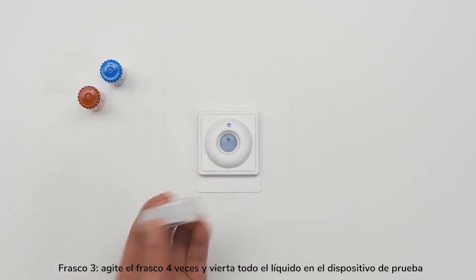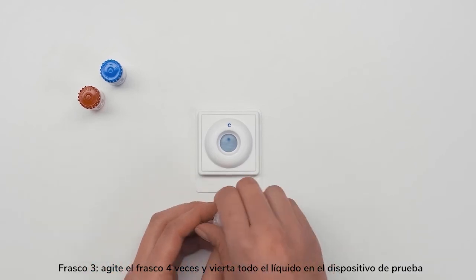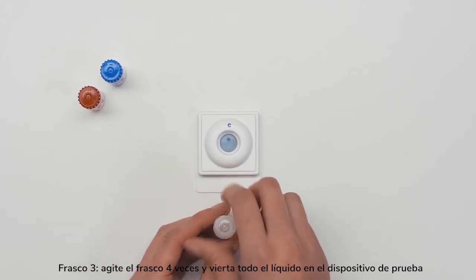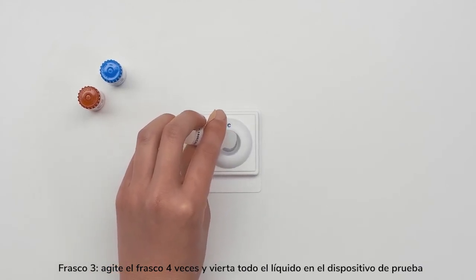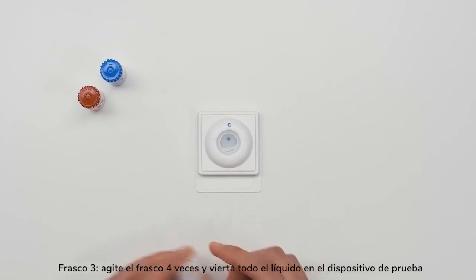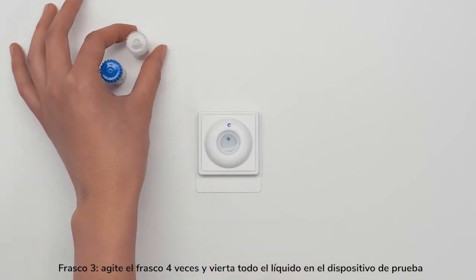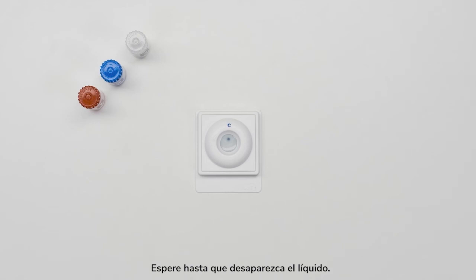Bottle 3: shake the bottle 4 times and pour all of the liquid into the test device. Wait until the liquid disappears.